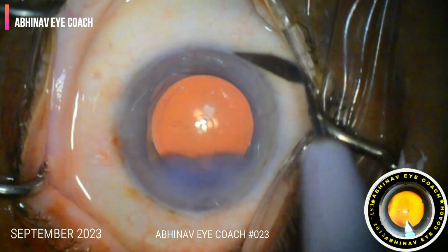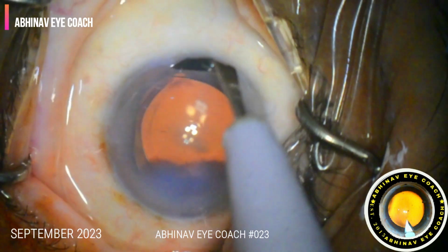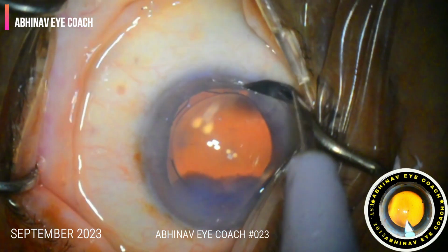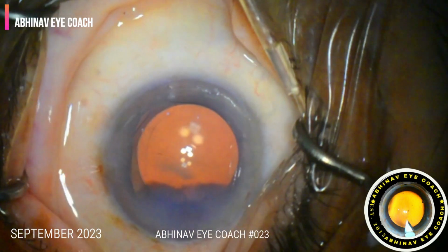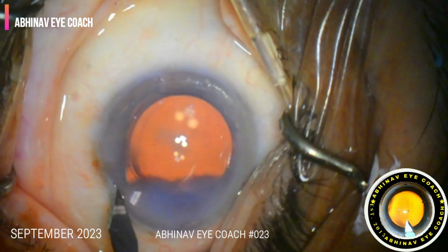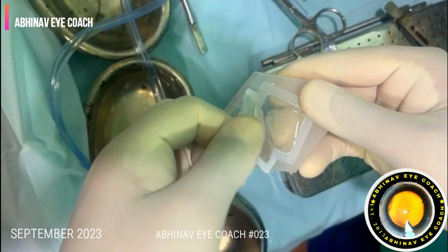Here I am performing limbal relaxing incision as the patient had one diopter of astigmatism against the rule. So we can give limbal relaxing incisions or paired limbal relaxing incisions.